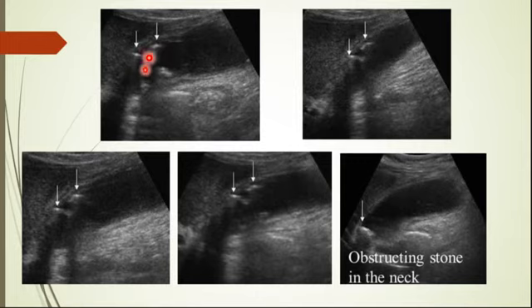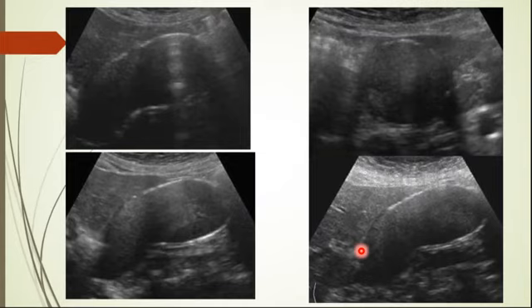These are just air bubbles within the gallbladder lumen, and you can see a stone in the neck of the gallbladder. So it can also be air bubbles. Air bubbles might also be introduced by ERCP, in patients who had endoscopy for the papillotomy or something like that.